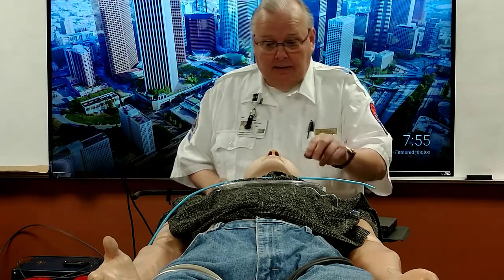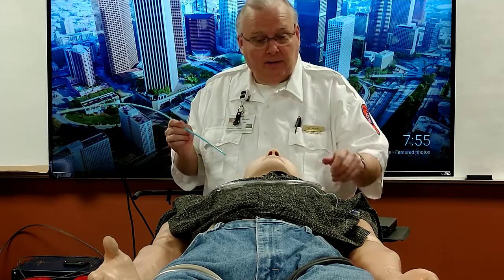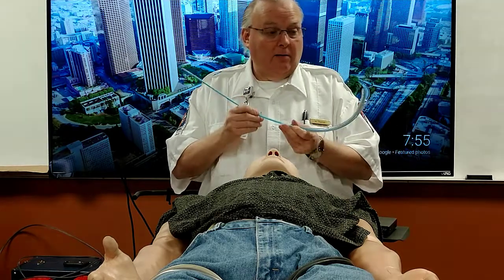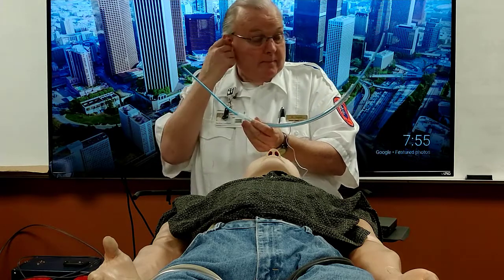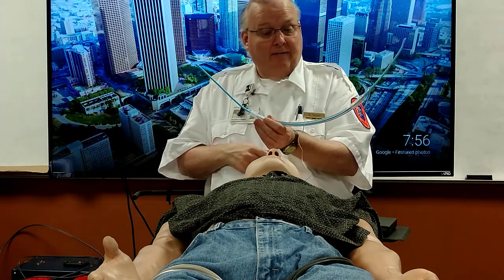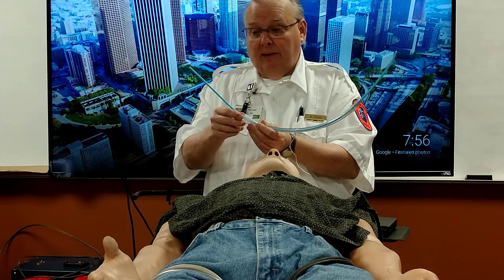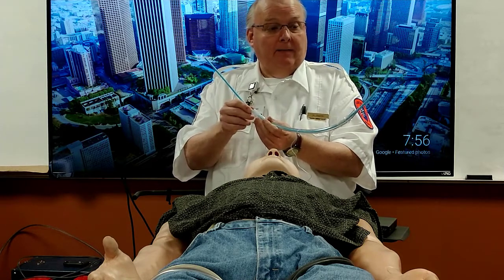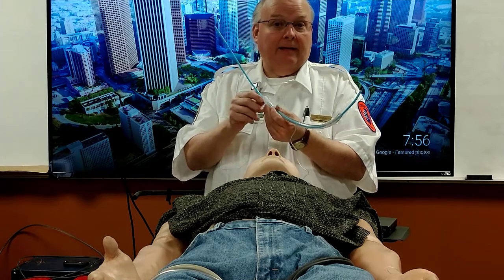The next thing is, we've prepared our equipment. I showed you that just a minute ago. We're going to prepare our tube. It's important to put the tube about halfway, where about equal amounts of the bougie are sticking out from either end, and then go down just a little bit more from that.